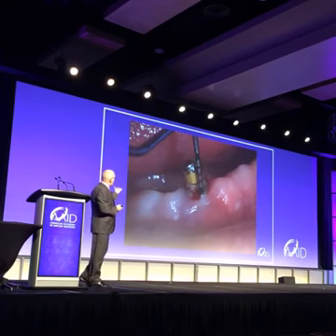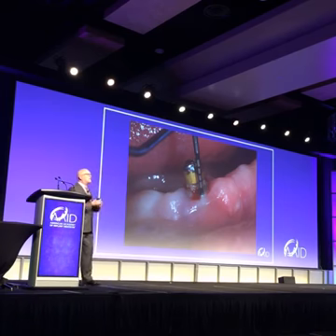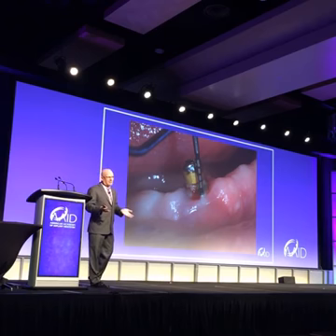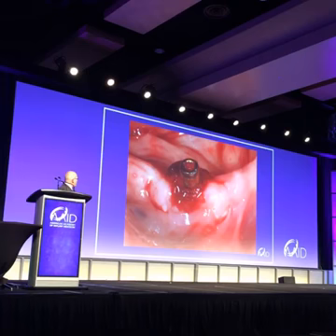You can see this is about a 9 to 10 millimeter pocket. You can see the separation and everything else. If you try to flap this open, it's going to bleed everywhere, and it's going to be a mess. So let's get the inflammation down first and see where we are. So we went ahead and treated her with the LAPIP protocol.